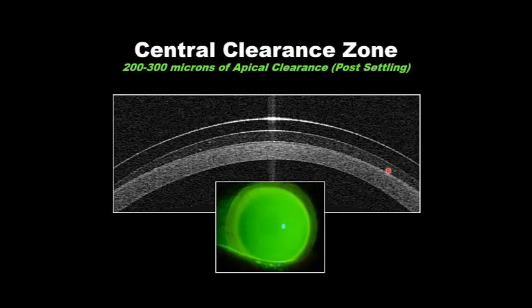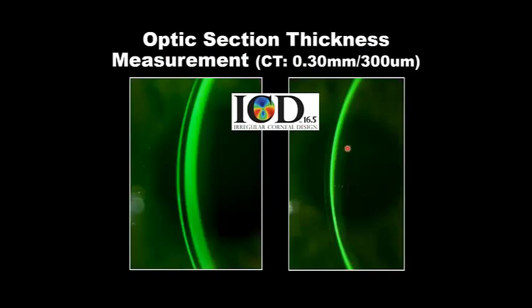So having enough apical clearance generally allows for that lens to vault where the cornea may not be symmetric, where you may have a high elevation that's needed to clear. In an ocular surface environment, imagine that fluid layer, that bath between lens and cornea throughout the day, creating that wet environment that allows for a healthy epithelium.